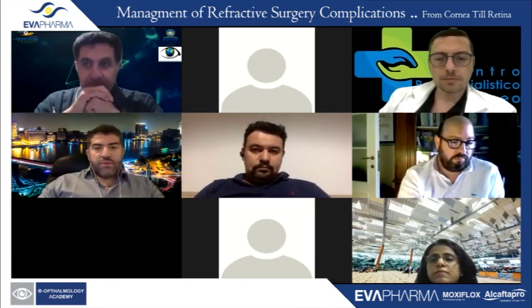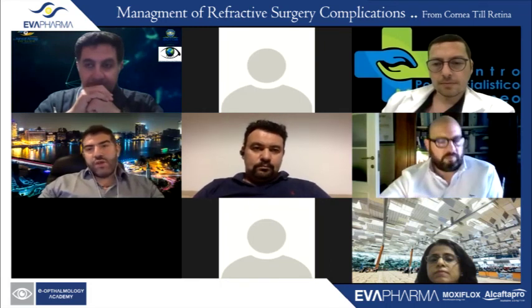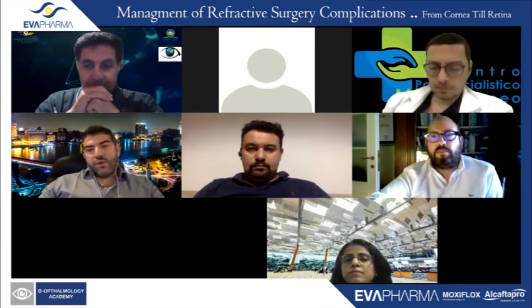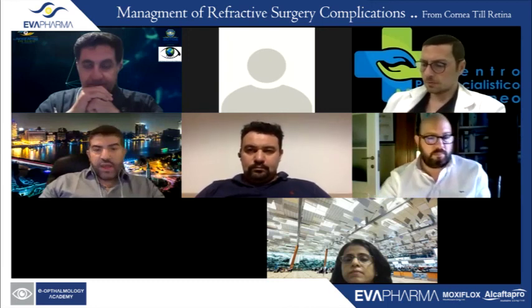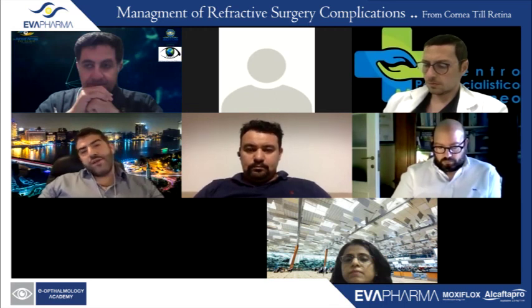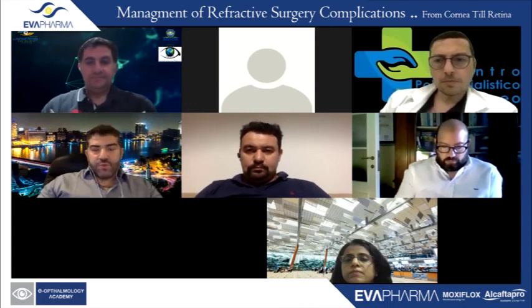But the problem comes when you have incomplete vitreous detachment, because when you go for a YAG capsulotomy, for example after a refractive lens exchange, and you make an opening of the posterior capsule, inadvertently you can open the anterior hyaloid, and this opening would cause the liquefied vitreous in these very high myopes to escape into the potential space between the vitreous and the retina, predisposing to premature vitreous separation.